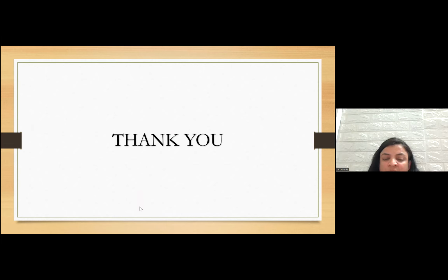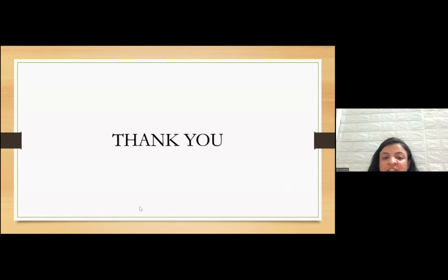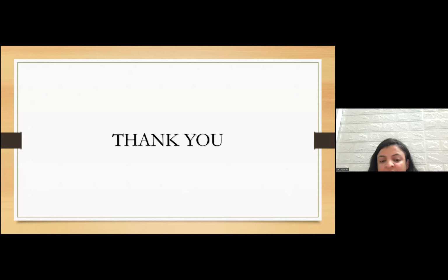There is one question on open apex. Someone is asking that in open apex, what precaution should we take prior to the irrigation? When we do irrigation in open apex cases, we need to make sure that our needle is 2 millimeters shorter than the actual working length. That is the first thing. Second thing is I would always prefer to use side-vented needles instead of normal LA needles. Usually we should not use LA needles. LA needles should only be used for administering local anesthesia, and you can even use them for saline irrigation, but for hypochlorite or chlorhexidine or EDTA, I won't suggest the LA needle. You can use side-vented needles. And pressure also you need to be very careful with. You just cannot put a lot of pressure while delivering the hypochlorite.